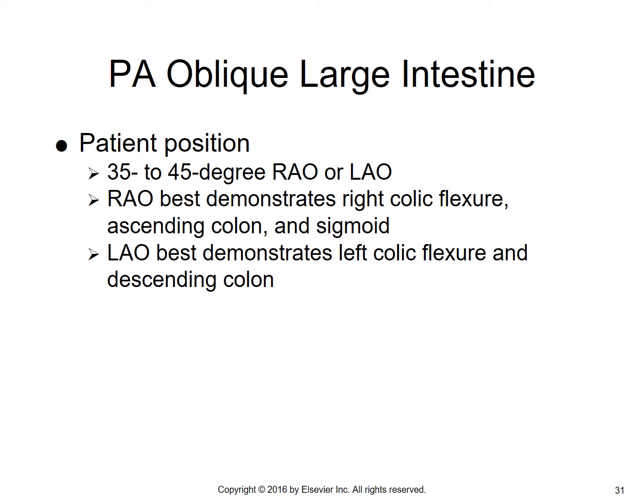For PA obliques, which are RAO or LAO, it's going to be standardized depending on the institution you're at, 35 to 45 degrees. Memorize this, very, very important.